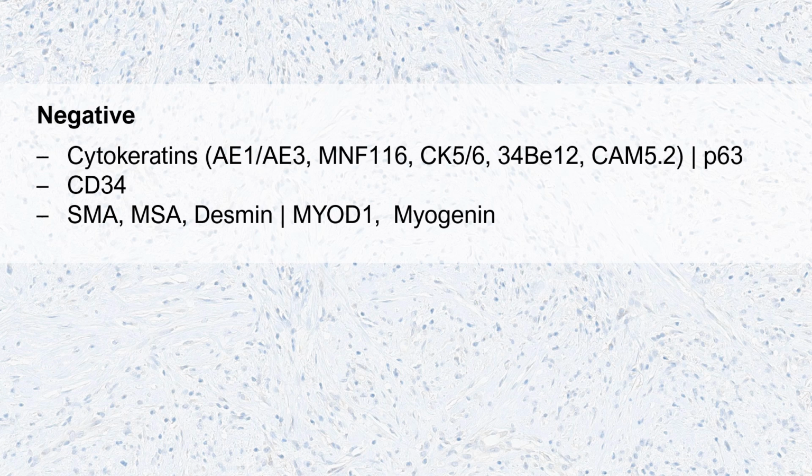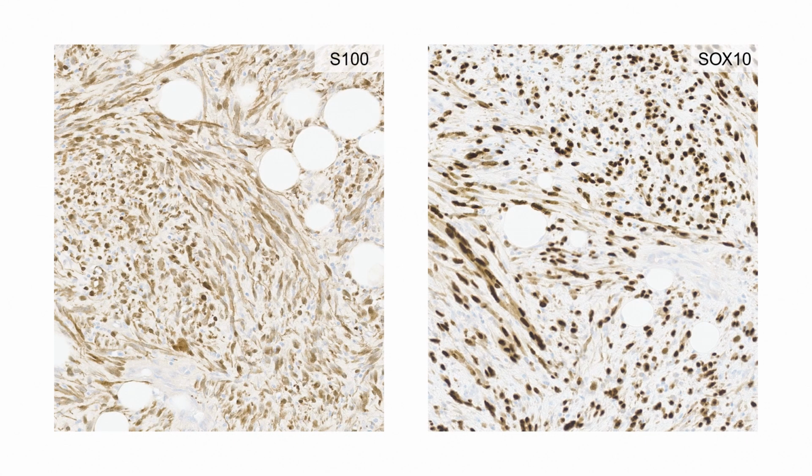Probabilistically, the most likely explanation would, at this point, still be metaplastic carcinoma, given that we know that on limited sampling, in particular, you can see the lack of cytokeratin staining, whereas when you get a complete resection, you're often able to identify areas of tumoral heterogeneity, stain those, which then can corroborate a diagnosis of metaplastic carcinoma. However, given this limited sample, there was still one camp of lesion that I had not excluded. And so I performed an S100 and SOX10, both of which showed diffuse staining.